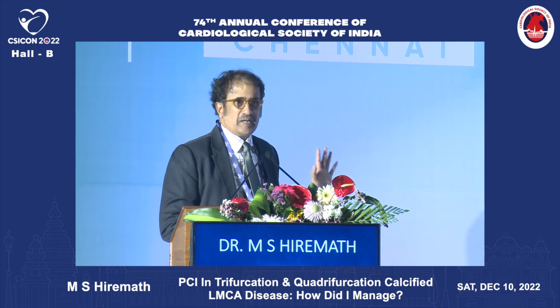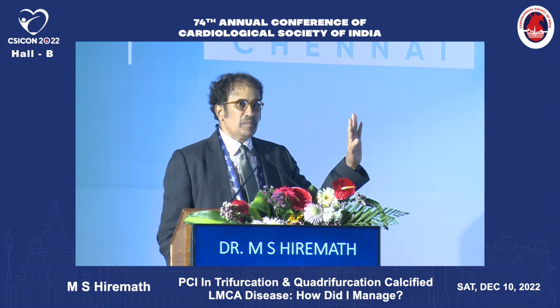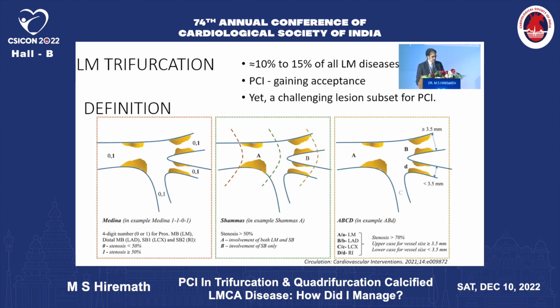So the title is in front of you. We are dealing with left main, which has multiple distal vessels, and this is the left main trifurcation. The incidence is about 10 to 15% in the literature.